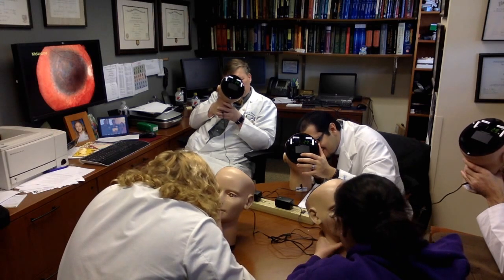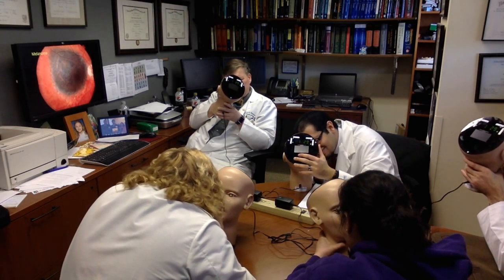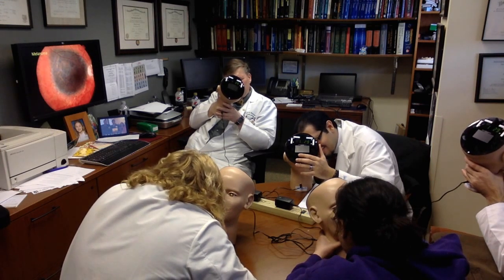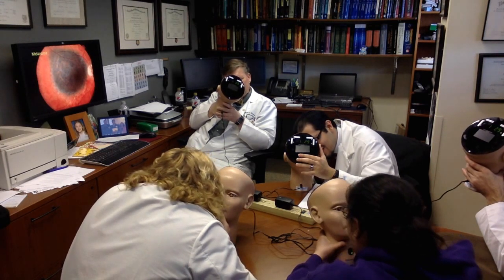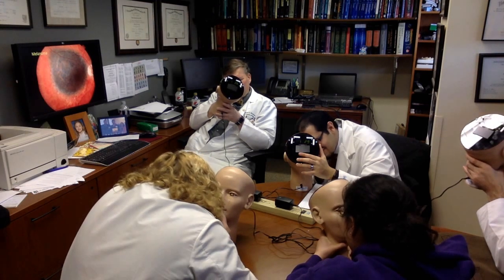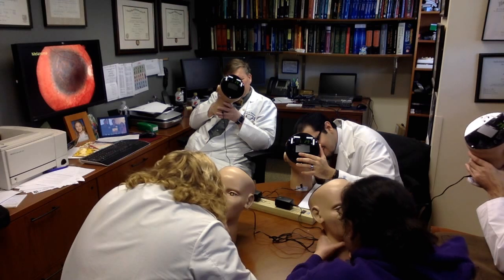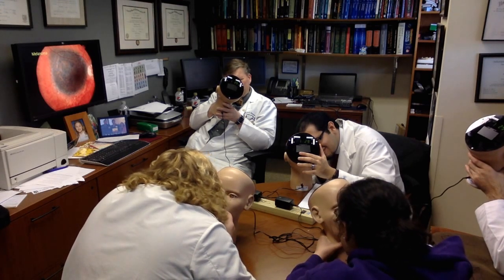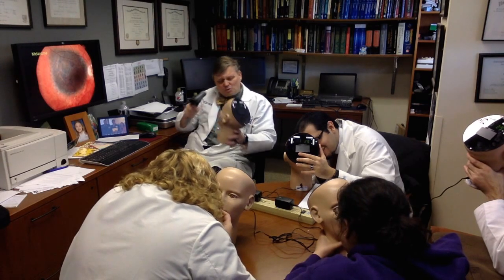And ask yourself, this blue-gray blob, are the margins distinct? Not as distinct. If you go into the middle of it, you can see some white dots. That's drusen. And you can see some whitish area above it, like some atrophy. And if you look closely, it looks flatter than the last one. Do you believe that? Yeah. It's not as obvious that it's raised.